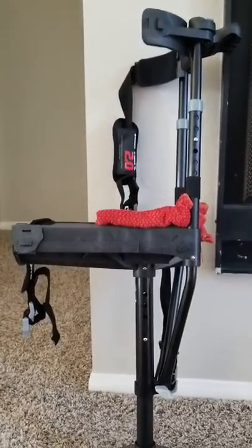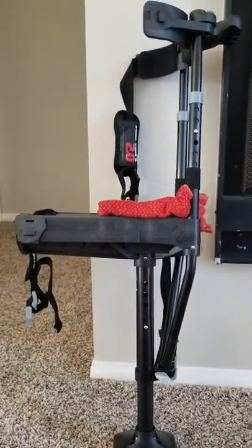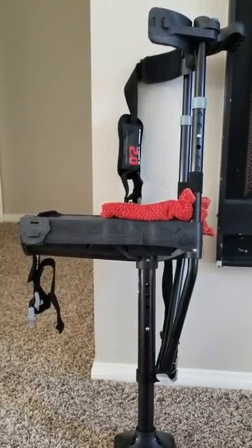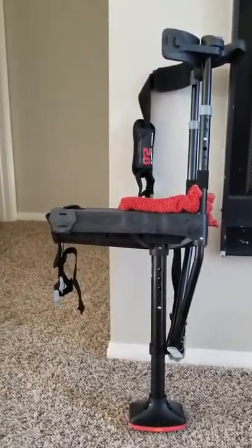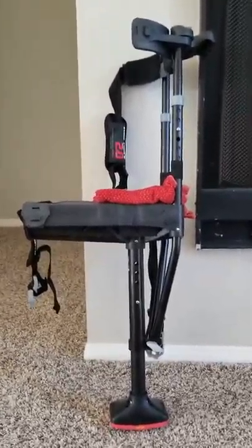I found this on OfferUp for $60. Brand new they're $150 — check Craigslist, check different places so you can get a great deal. And who knows, hopefully this one will be up for sale soon.